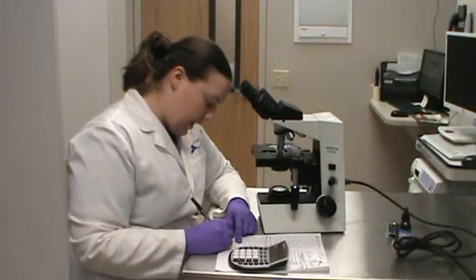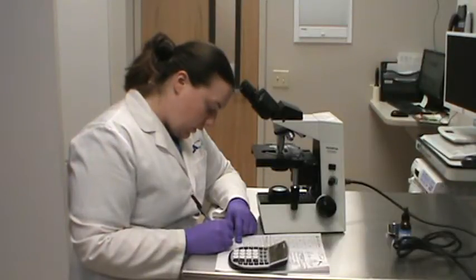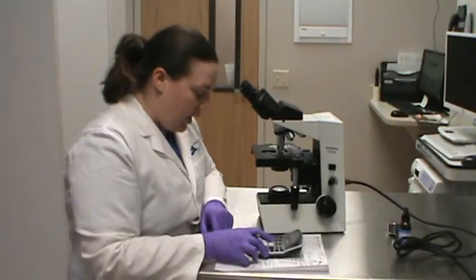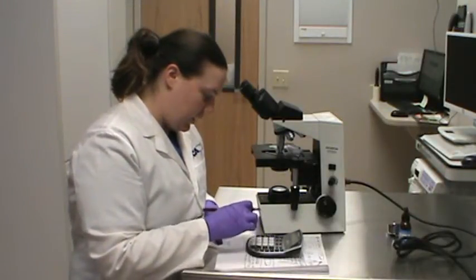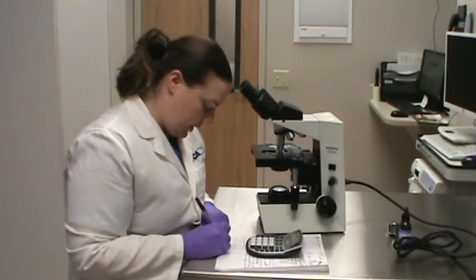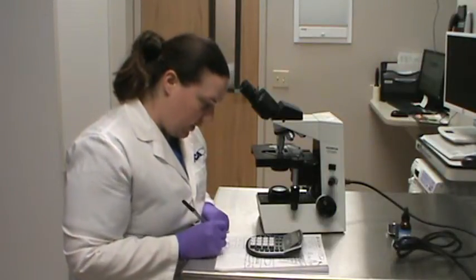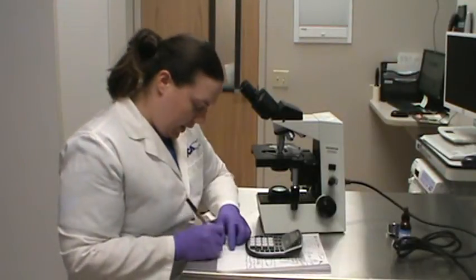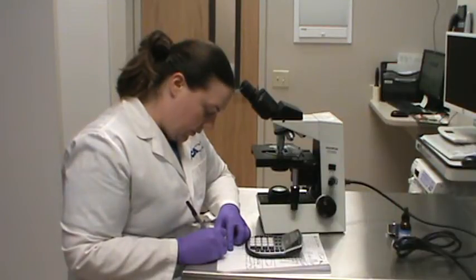That 4.5 is my average platelet count. Then we take the 4.5 and multiply it by 20,000, which equals 90,000 per microliter.